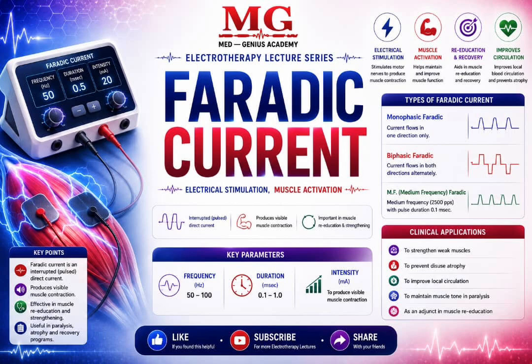Before we move on, we have to know that in electrotherapy we are using electricity, but not high electricity, low electricity, to provide treatment. We have the low frequency current, the medium frequency current, and the high frequency current. Here we're starting with the low frequency current. Low frequency current modalities are the Faradic current, the TENS, and iontophoresis, and many others. We'll also do the medium frequency current and the high frequency current.